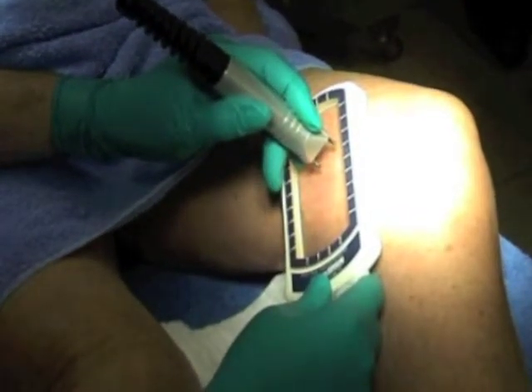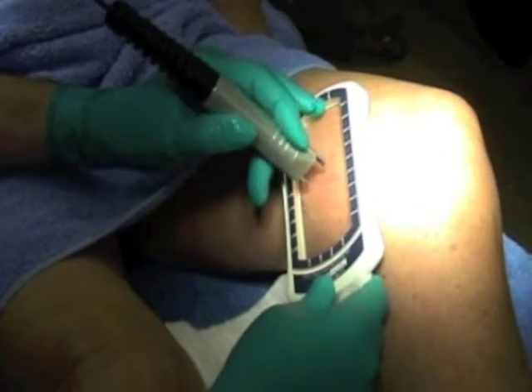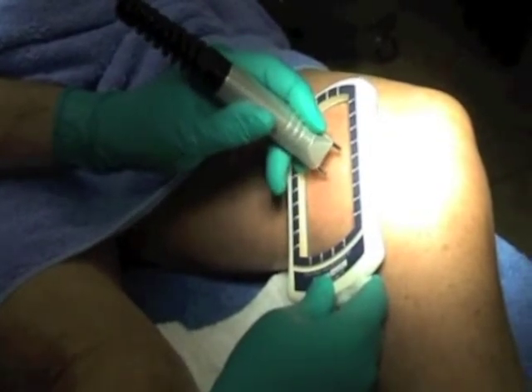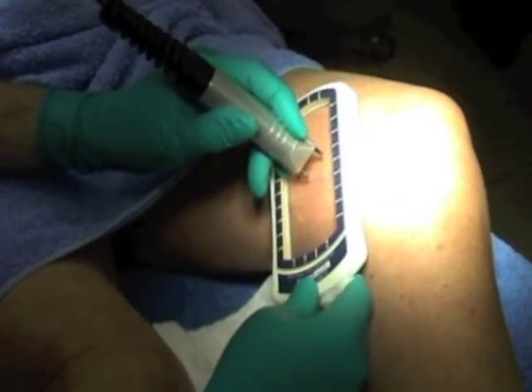You can take one point and slide on the skin, following the vessel like that. That's an interesting point — two systems. One way is to follow the vessel each time point by point; the other system is to keep it like that and follow your vessel by sliding. You will see it's very, very easy to use. I will demonstrate it.